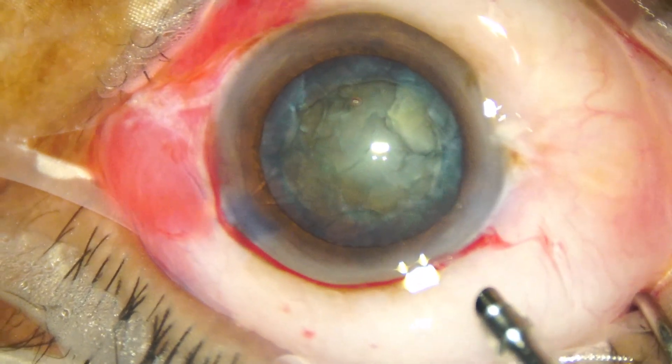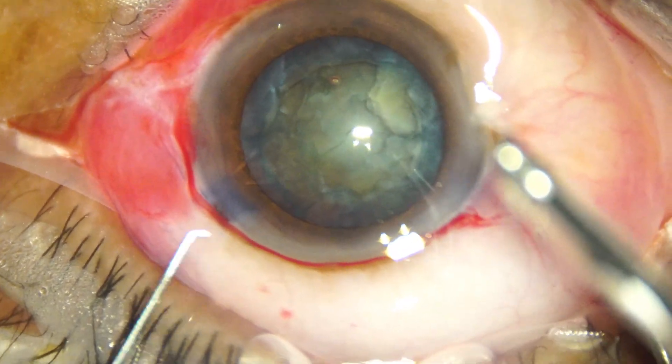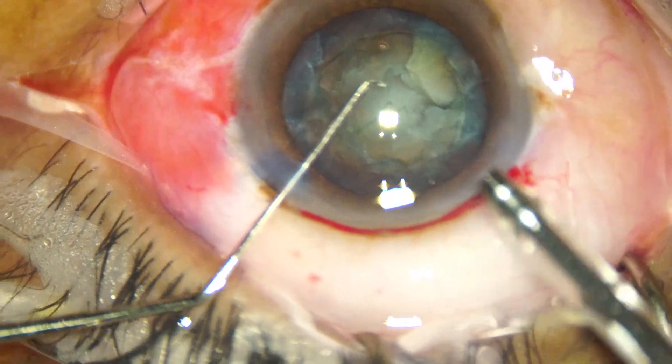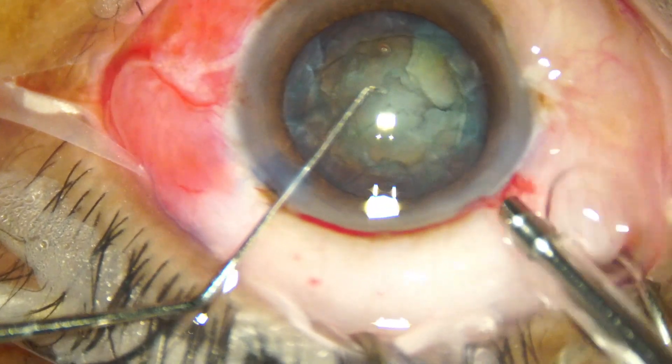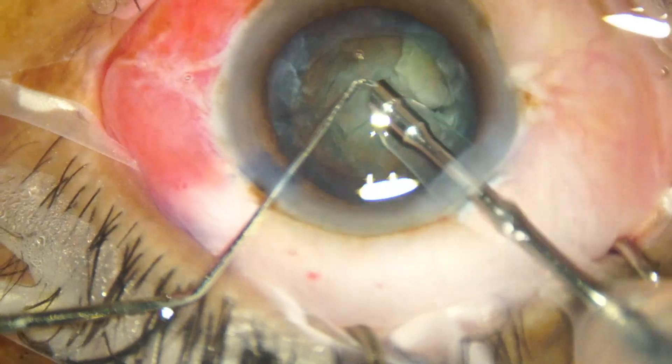And now it is time again to go into the anterior chamber. The chopper goes in, irrigation is on, and the handpiece goes into the anterior chamber.